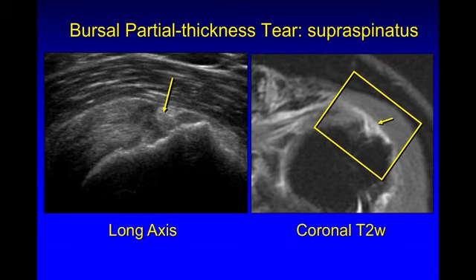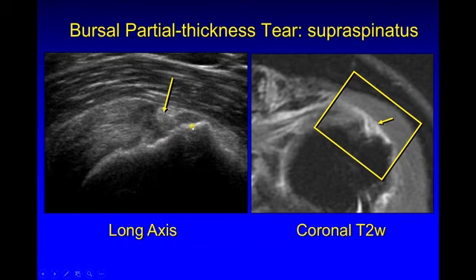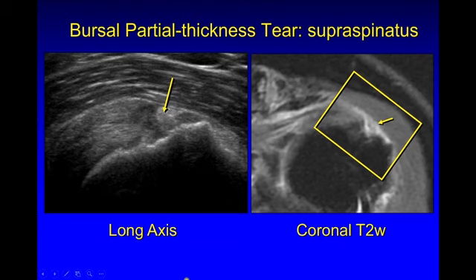Here in contrast is a partial thickness bursal-sided tear of the supraspinatus. If you look at the more superficial fibers of the supraspinatus, it should be convex superiorly, but instead there's a triangular defect touching the bursal surface extending to the greater tuberosity, also shown on MRI as fluid signal. The problem with these bursal-sided tears is that the defect tends to fill with more echogenic bursal thickening or synovitis, which also shows intermediate signal on the MRI.